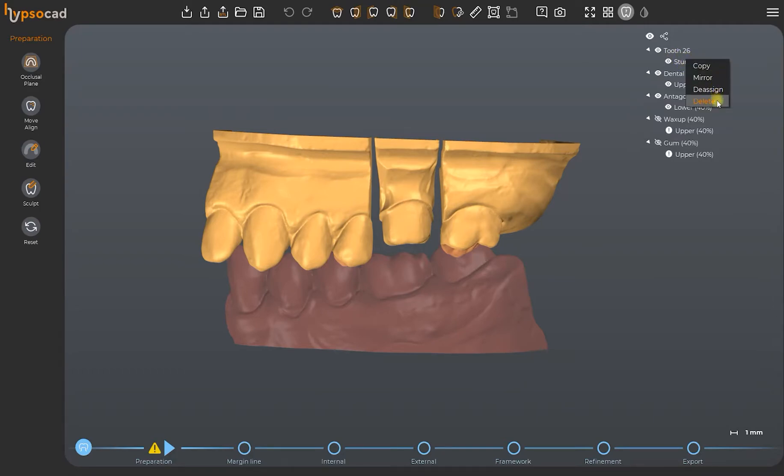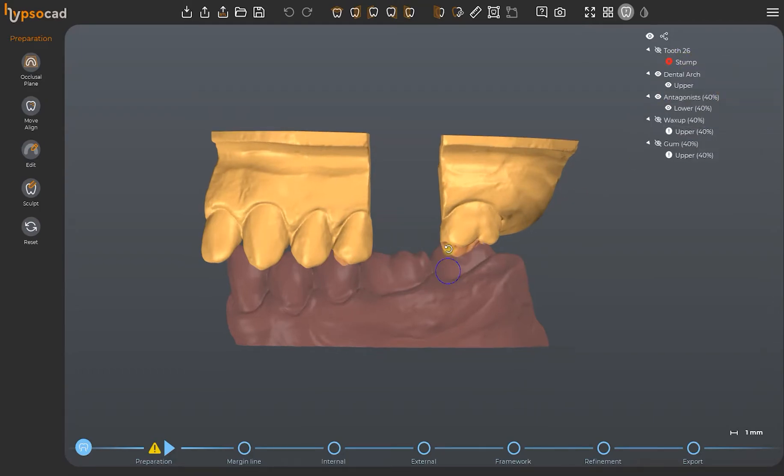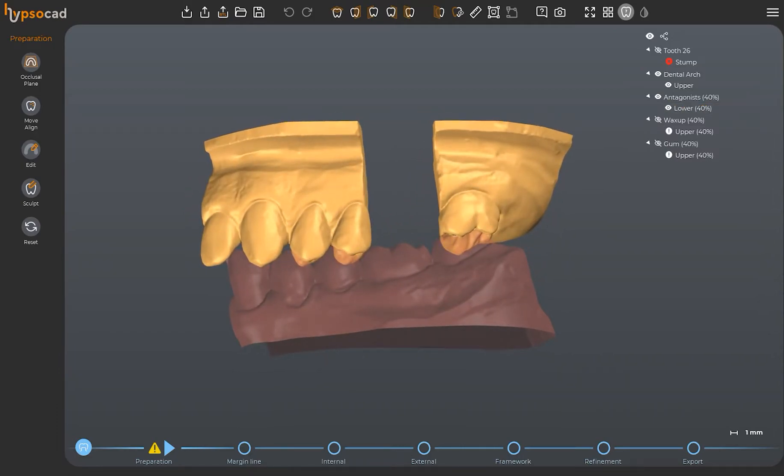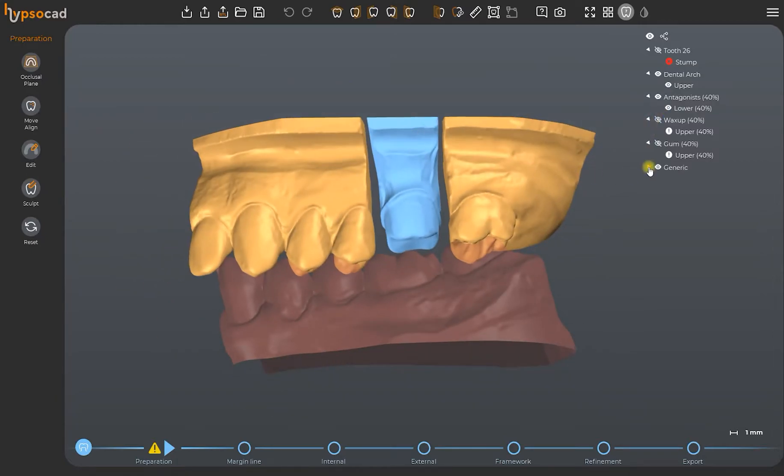You may also add meshes by drag-and-dropping them. By doing this, the meshes will be imported as generic. Subsequently, you can right-click and assign them to a specific function.